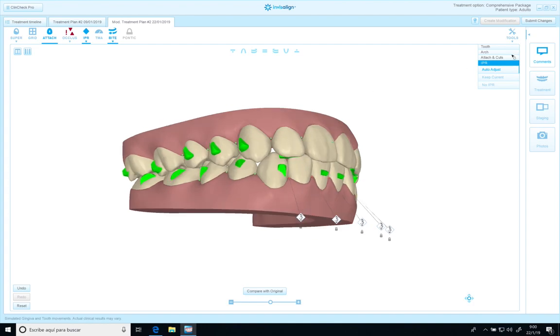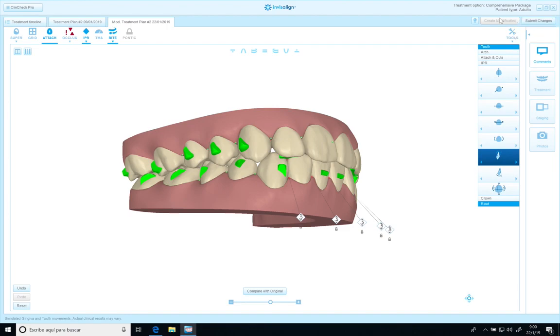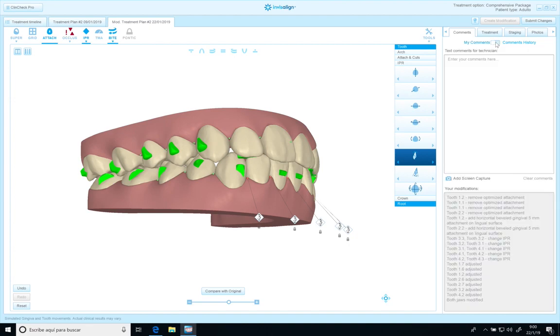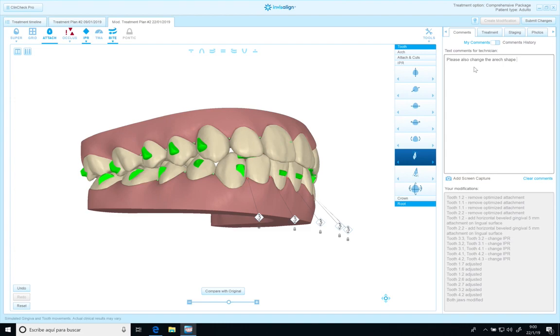Perfect. And now my instructions. Please also change, I'm going to change the arc shape to more parabolic.